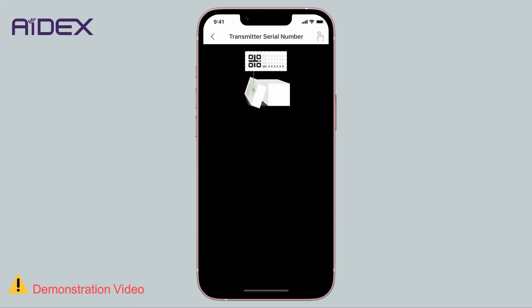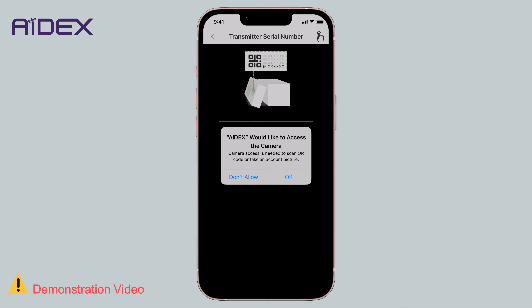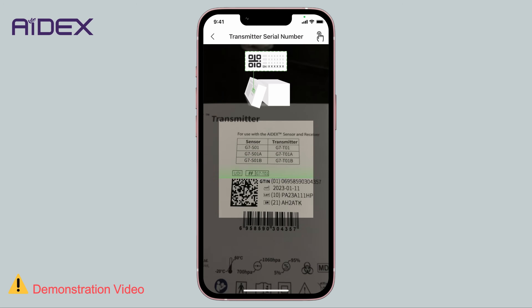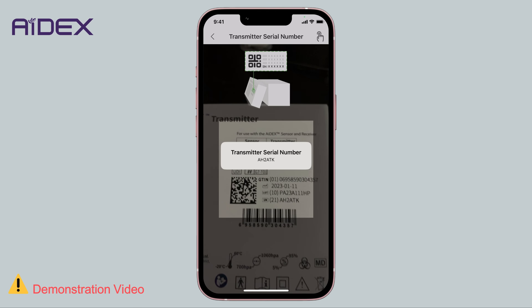First, you can press the scan icon. The app will request permission to use the camera. Confirm, and point the camera at the QR code on the packaging of the transmitter. Note that you should focus on the QR code, not the barcode.